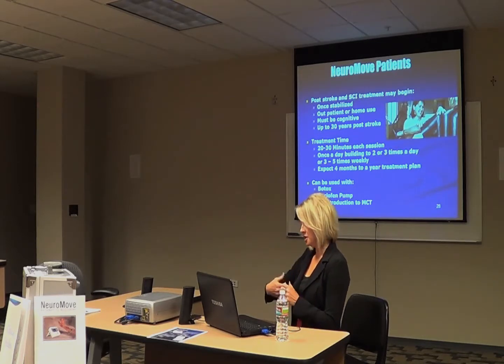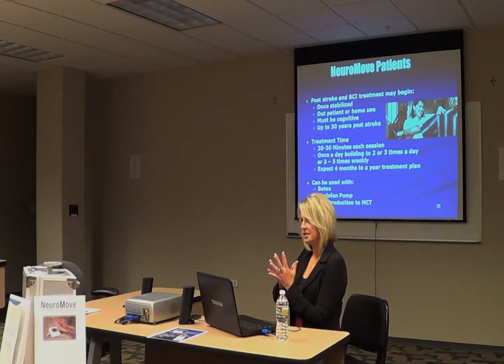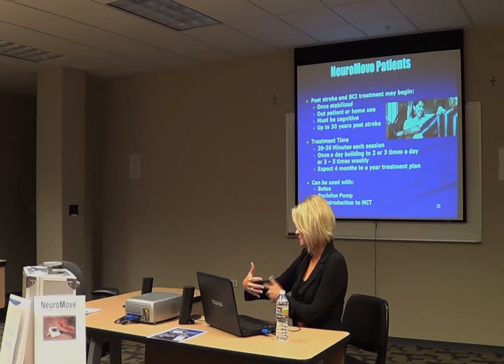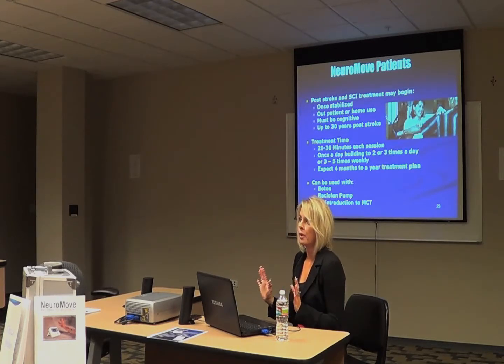So I worked with a patient and another therapist to kind of pull the patient's fingers. It took us about 20 minutes to actually get his fingers spread out because it hurts them. You have to really take time. They haven't opened their hand up. But during that time, we actually got his hand open. We padded it so it stayed open, and we used some tape on it. But when we started the process, he actually got some extension from it. So he wouldn't have been able to do that otherwise. These muscles are pulling and there's no hope for being able to do that. So that's an important part of it as therapists, but that's what you have to do to get them started, and it really does even help those patients.